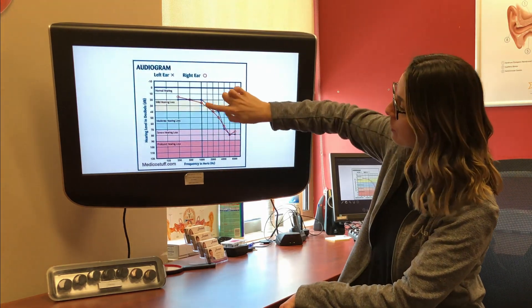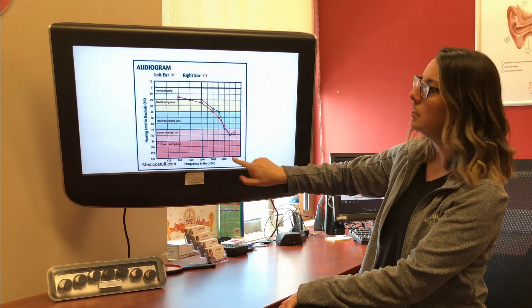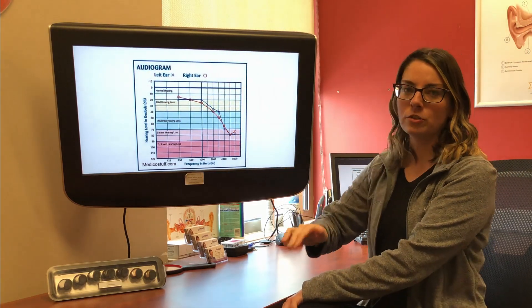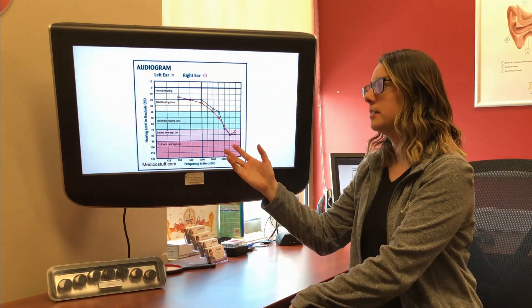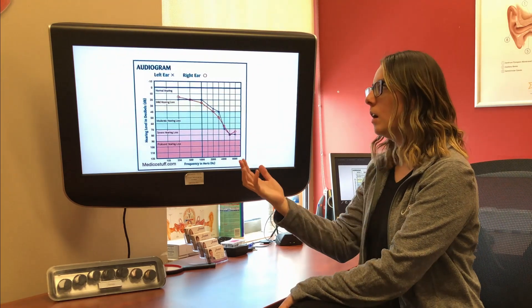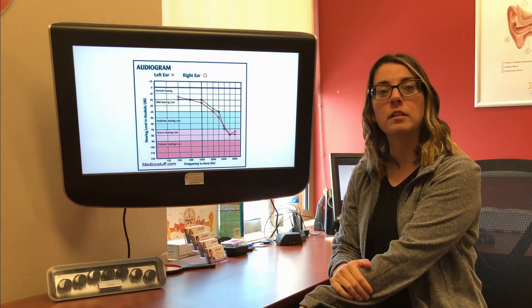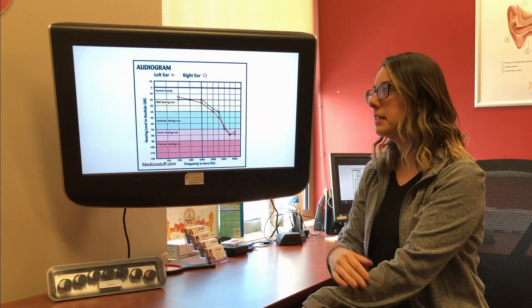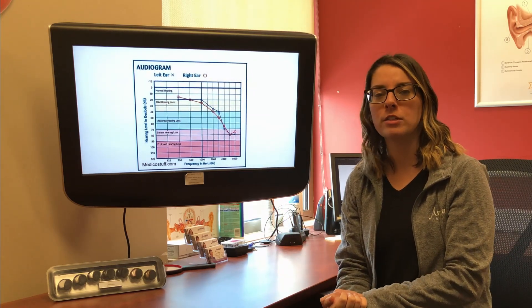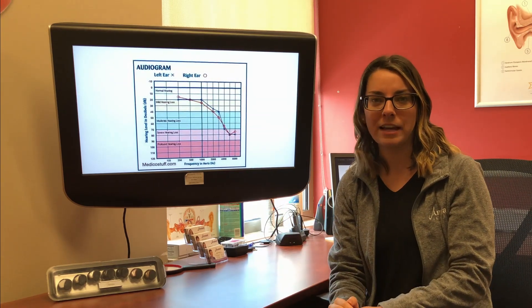So this person's audiogram — you can see in these low frequencies that their hearing is right about normal. Whenever we drop to these mid and high frequencies, the hearing loss starts to drop. This is a very common configuration. A lot of times with a hearing loss like this, the person can hear but not necessarily understand everything that was said.